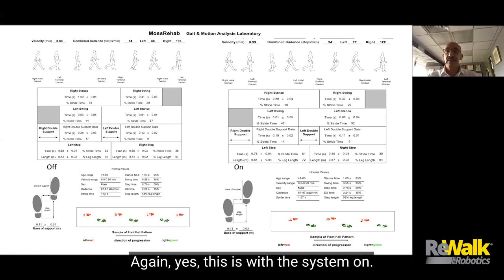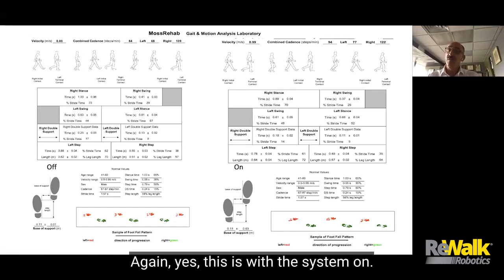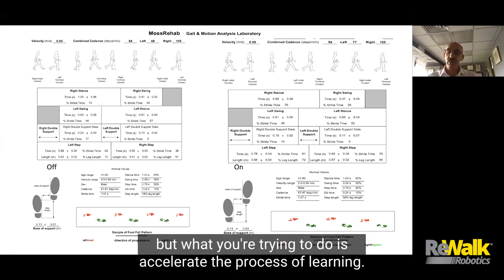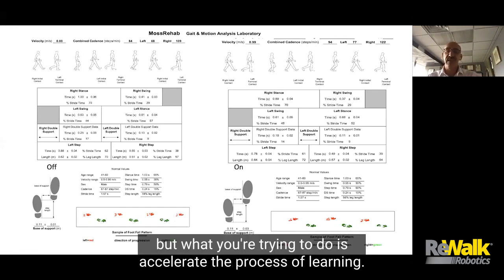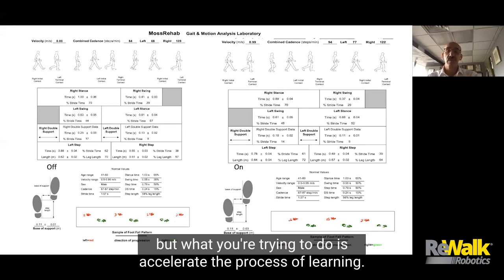Again, yes, this is with the system on. So you're relying on the system, but what you're trying to do is accelerate the process of learning.